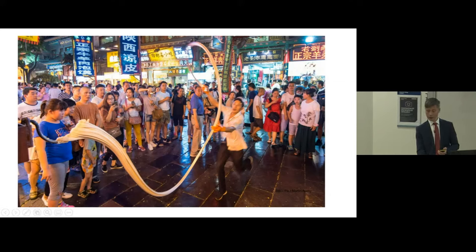But what I also want to draw your attention to are some features of the image. There are parts of the image that are very clear, but parts that are quite blurred. This is a two-dimensional image, but because of the blurriness, you can actually infer the third dimension, which is time, right? You know this object is moving over time.